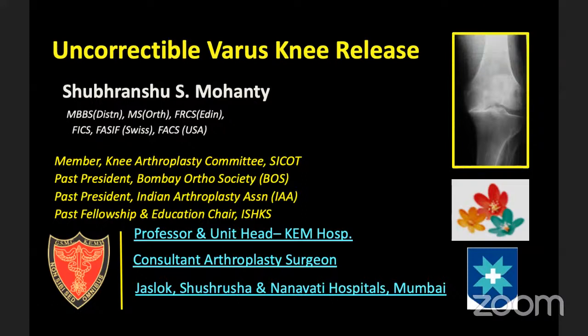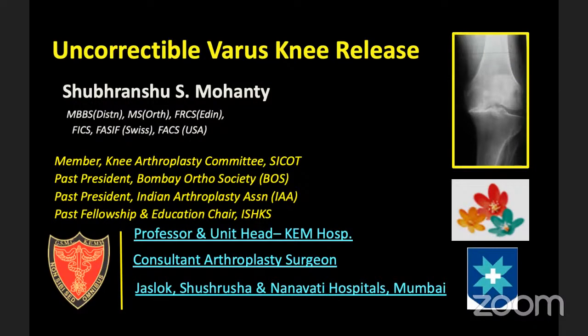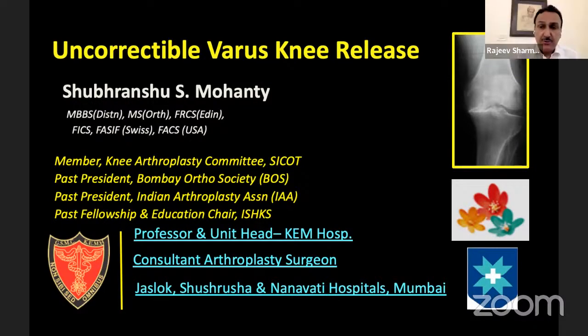Dr. Gaurav, if I may take up your question. If you have an accidental avulsion of the medial epicondyle from the femur, and the fragment is big enough to take a screw, what Dr. Deva said is very right: a screw with a washer is a very good option. But I'll suggest to all our younger colleagues that you keep anchor sutures ready, at least one or two, in the operation theater, because that comes very handy in this kind of situation.